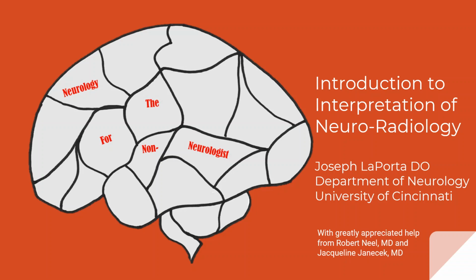Radiology is really actually a pretty essential part of neurology. I guarantee you're going to be seeing imaging pretty much every day on your neurology rotation, and so it's just a really great skill to understand the basics of. So let's dive in.